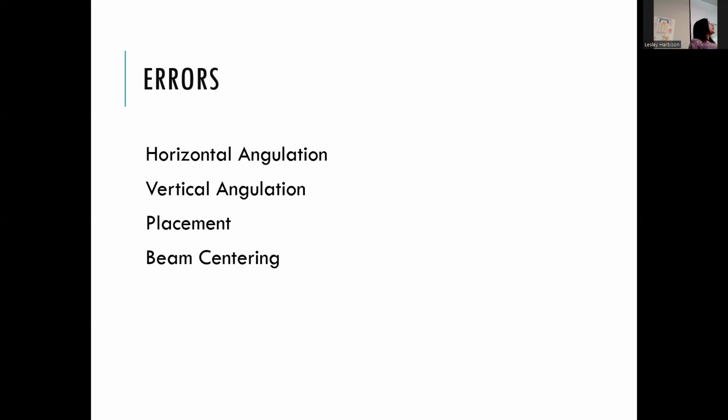And there are measuring devices in the digital x-rays. You actually can pull up little measuring devices, but that can be tricky, and you don't want to end up screwing up your film somehow. But anyways, you just eyeball it. If it looks like it's a little bit less than half, then you're probably good. If it's just a sliver, you're good. But if it looks like it's half or obviously more, then you have to retake it.